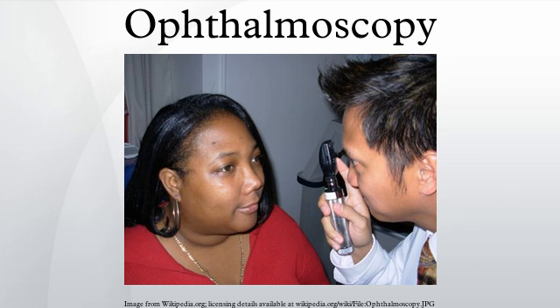An indirect ophthalmoscope, on the other hand, constitutes a light attached to a headband, in addition to a small handheld lens. It provides a wider view of the inside of the eye. Furthermore, it allows a better view of the fundus of the eye, even if the lens is crowded by cataracts. An indirect ophthalmoscope can be either monocular or binocular. It is used for peripheral viewing of the retina.